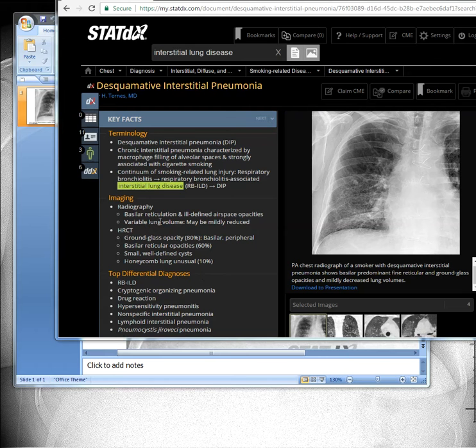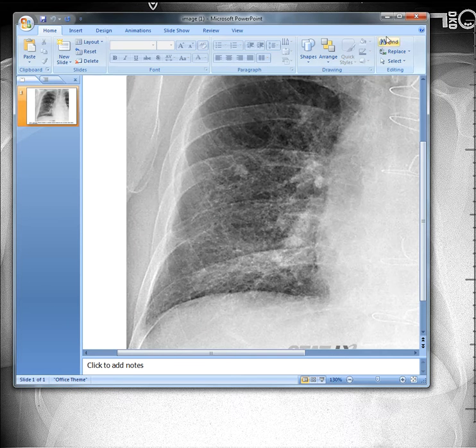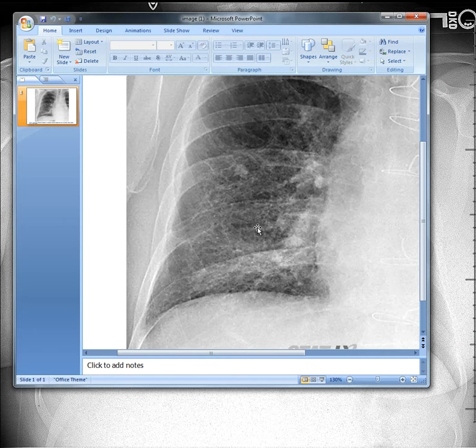The presentation of DIP is bilateral basilar reticulation and ill-defined airspace opacity, and the lung volume may be mildly reduced. You can see this is a disease with a reticular network kind of presentation, versus this area which is relatively normal.